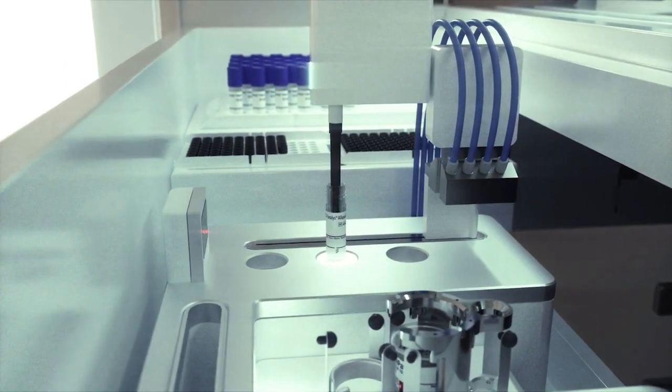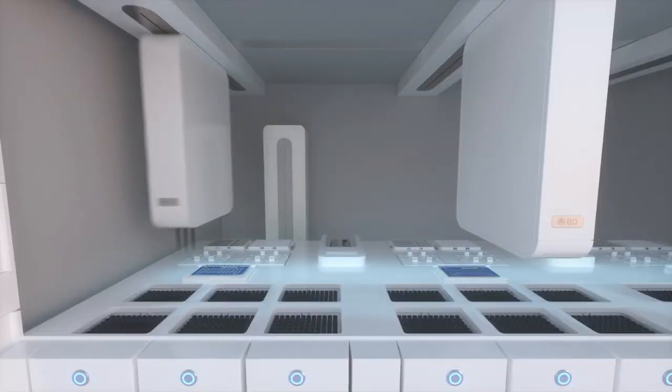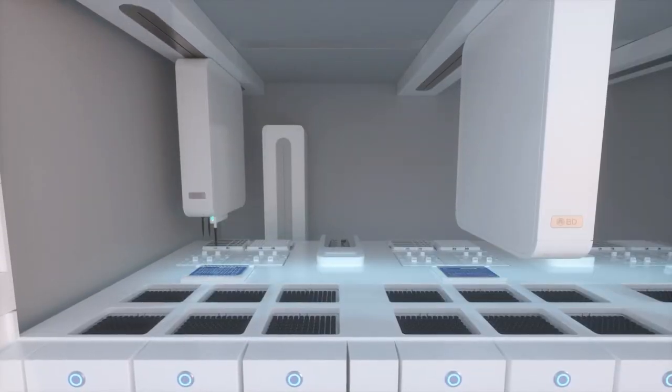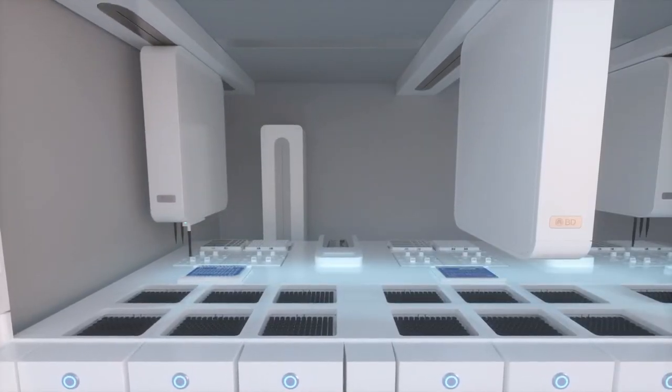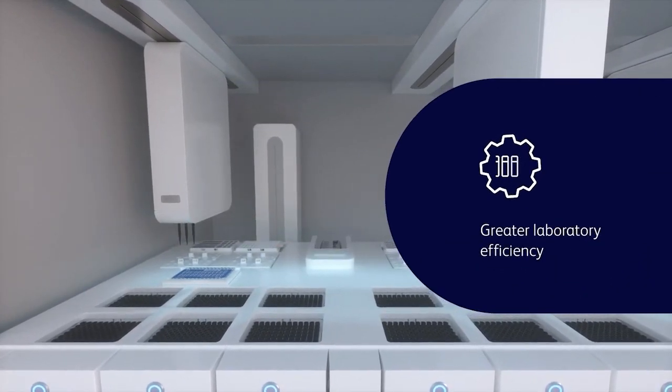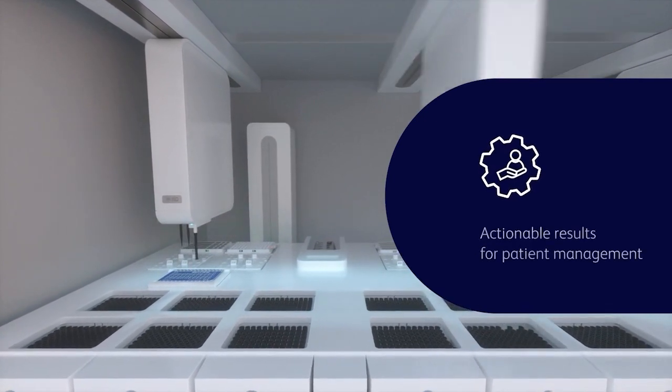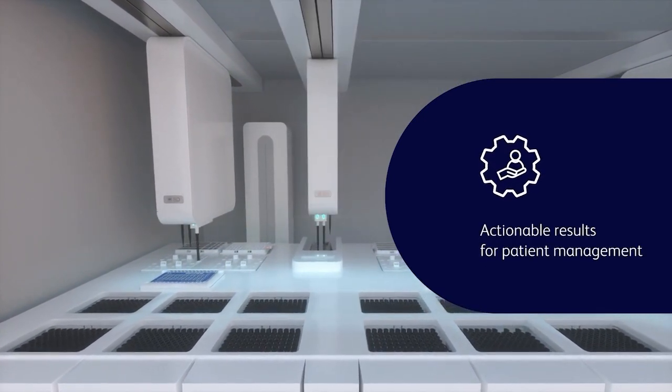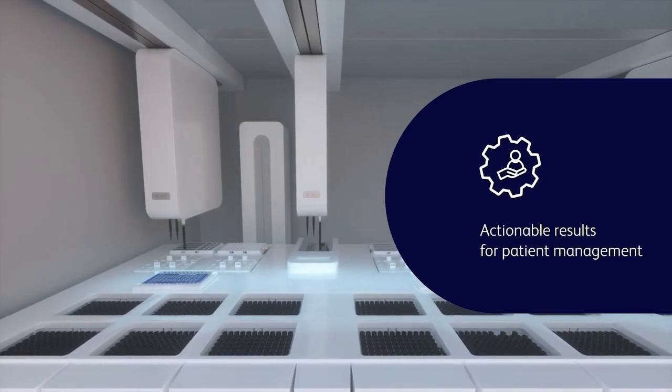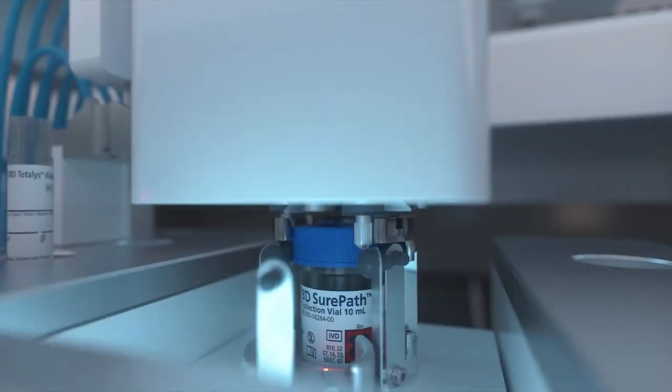The BD Core System performance is enhanced by accurate multiplex PCR assays designed to drive greater laboratory efficiency and provide actionable results for patient management. BD Core System delivers flexibility.